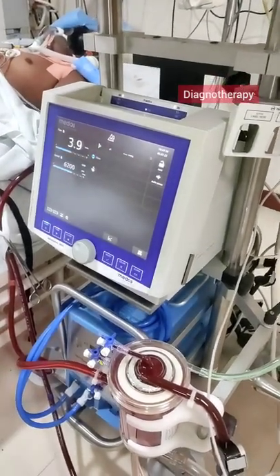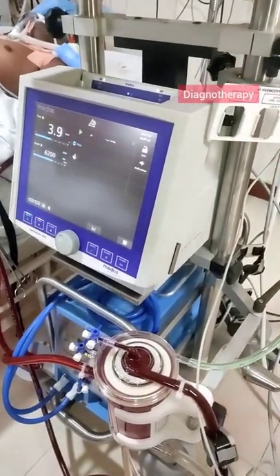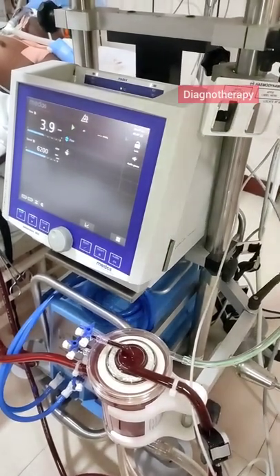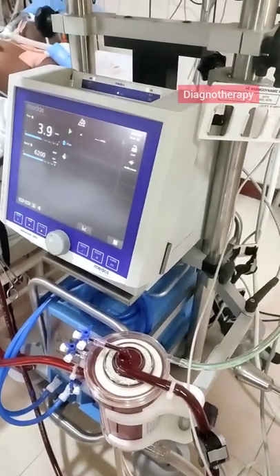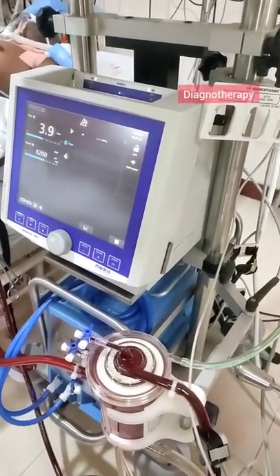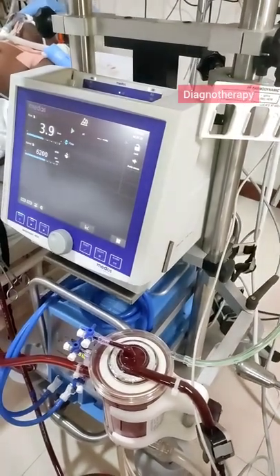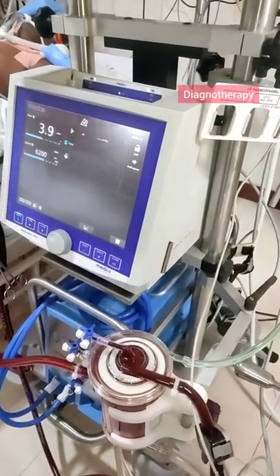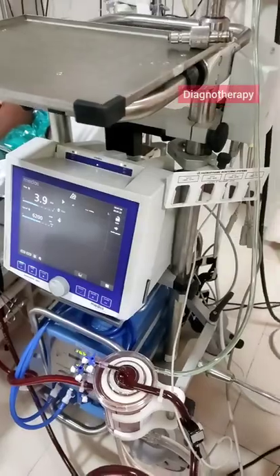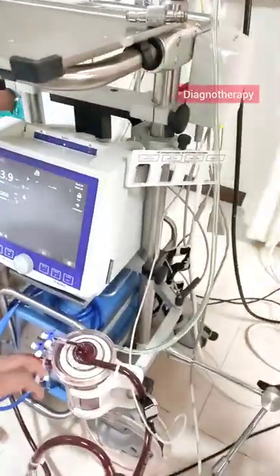From one tubing the blood comes out and goes to the centrifugal motor. Then the blood goes to the oxygenator where oxygenation takes place. It also maintains the blood temperature so that the same temperature as inside the body is maintained.